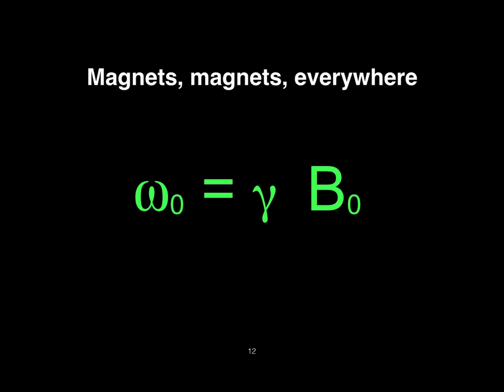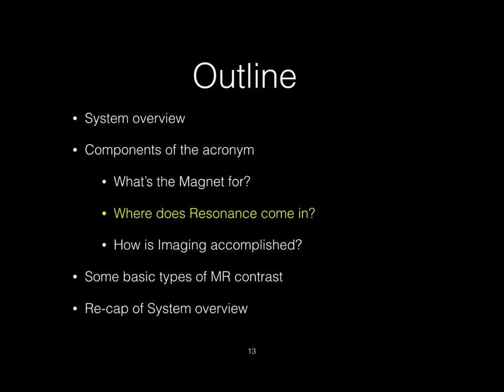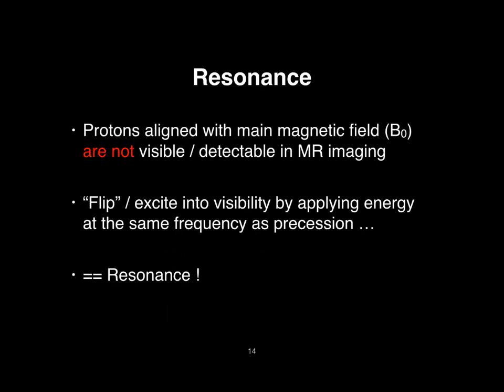All right. So this is kind of what the magnet is doing. It's essentially creating this other little magnet that's now in the sample, and it essentially is creating something for us that we can try to detect with the other parts of the experiment. Okay. So this is where the resonance part of the experiment comes in. Now remember we have this large, strong magnet, and now we've taken the protons in our sample and we've lined them up, and they're parallel to that main field.